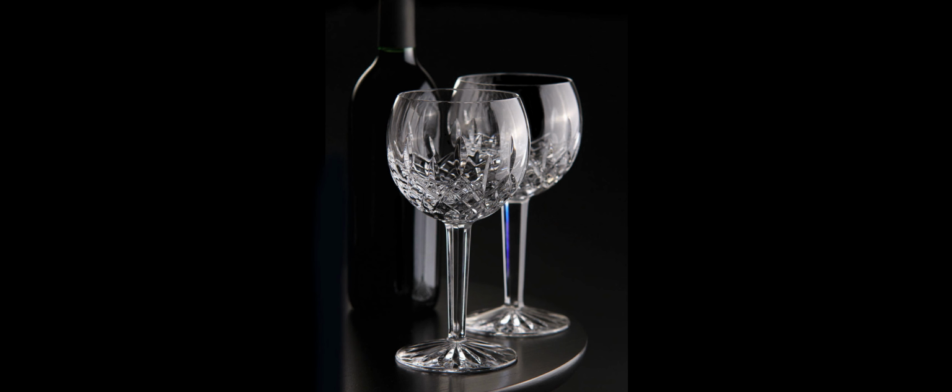Imagine the crystals in the surface of the transducer like your mother's fine crystal. This is the sort of thing you would have the good grace to take care of, understanding that if you drop crystal, it'll shatter. And unfortunately, that equates to not insignificant amounts of money, sometimes upwards of $15,000 for a replacement transducer.